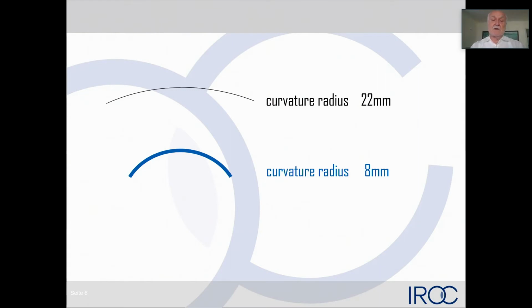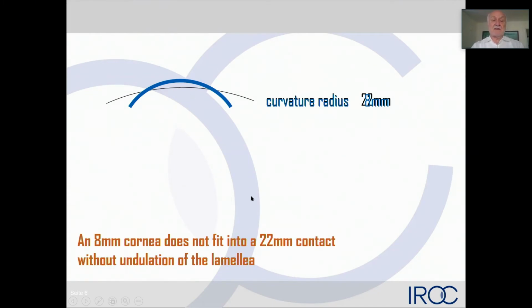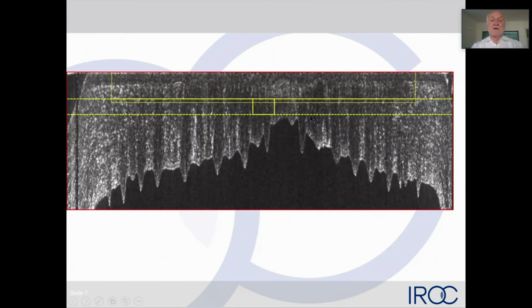Yes. If you look at this cornea with a curvature radius of 8 millimeters and the curvature of the interface, you may recognize that there is extra tissue if they are applanated, which means that from here to there, the distance between the touching points is wider than that one. We will have to live with the fact that the cornea has to be contracted or fixed, and as a response you get those undulations of the cornea, because that line is bigger than that one. So in essence, those undulations can be calculated from the shortening of that seam between the touching points, and that's what we did.